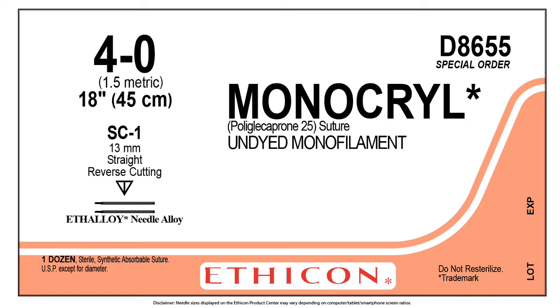Did I get it right? Oh no, sorry. This is the length of the needle, which is 13 millimeters. This is a straight needle, as you can see here, and it is a reverse cutting needle. So when you cut the needle transversely, this is what you will see.